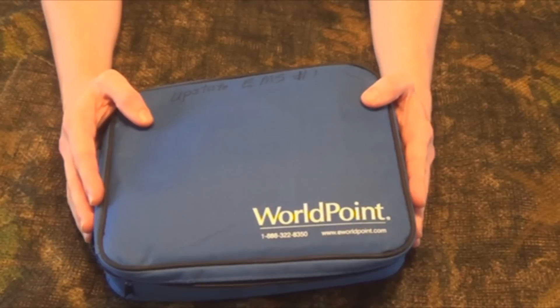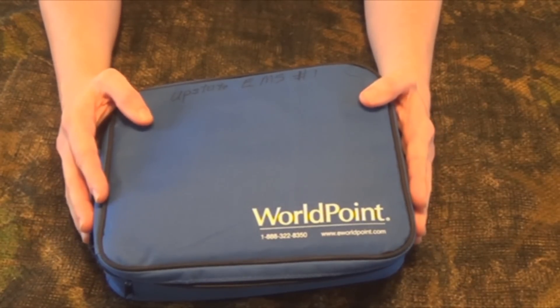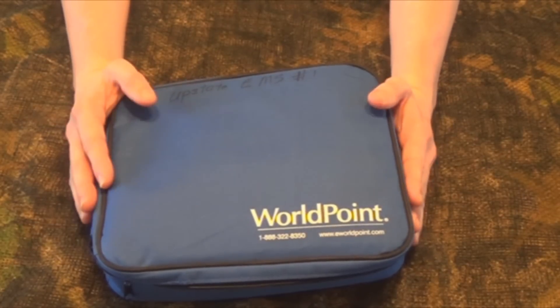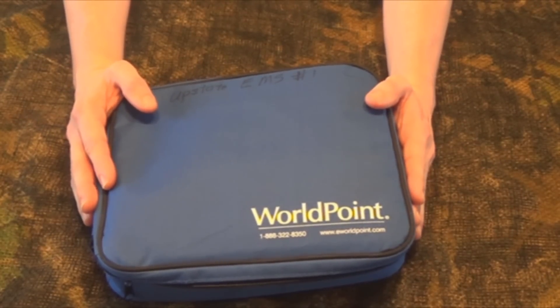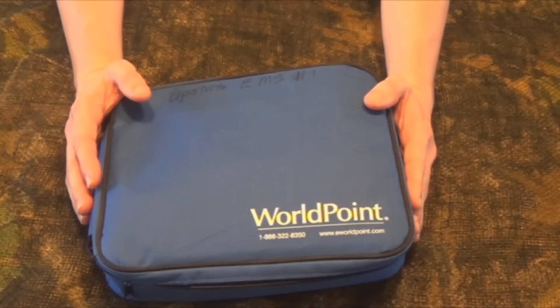AEDs are becoming more common. You're finding them in public places such as malls, movie theaters, schools, and churches. They're all a little bit different, but once you get the basics down, you know how to use each and every one of them. Some of them turn on when you open the case, and some of them you actually have to turn on manually — but the most important thing is to get the AED to turn on.